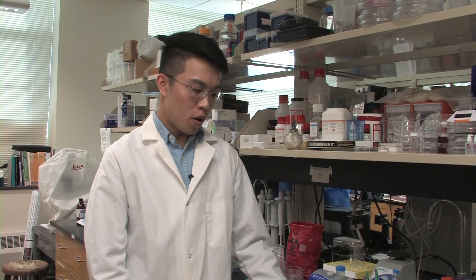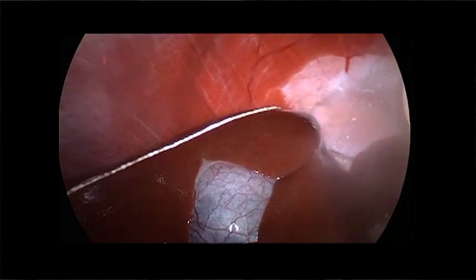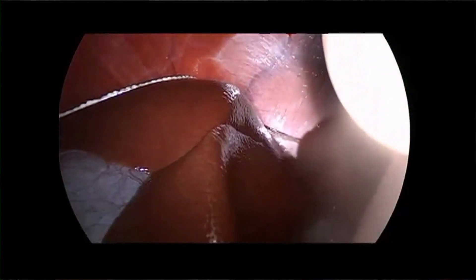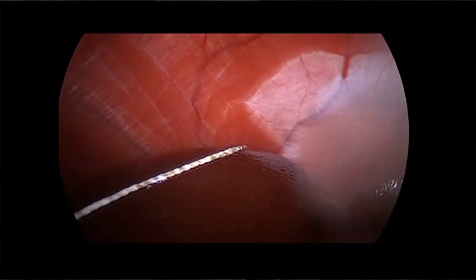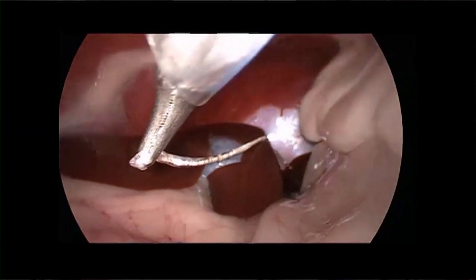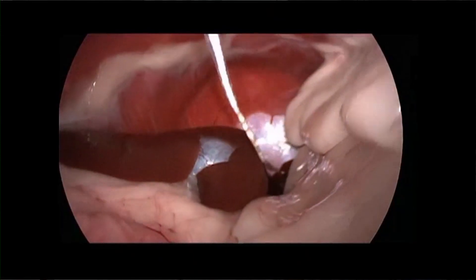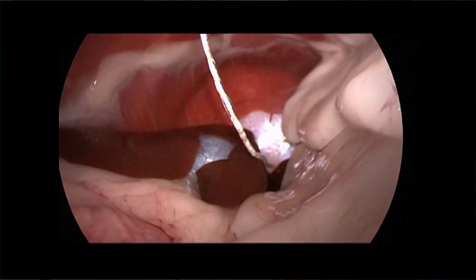Once the cell encapsulation device is prepared, I gave it to our collaborators and they helped us transplant this device into the animals. After a while, we can either retrieve or replace the device through a minimally invasive laparoscopic procedure. Our team is working very hard on pushing this project forward, and we hope one day it will be used in human patients.